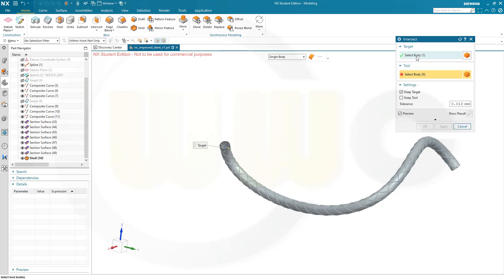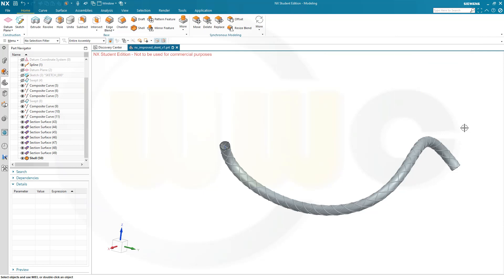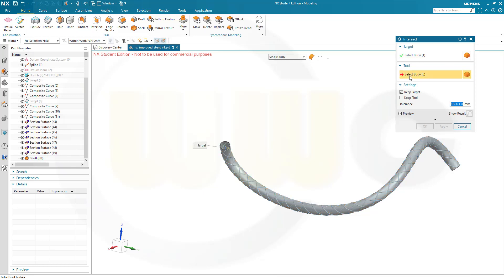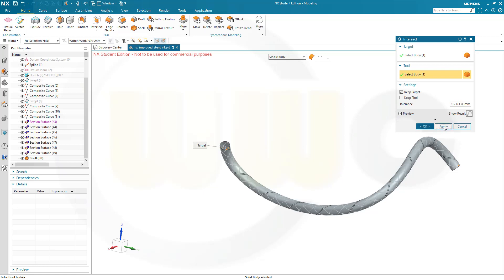The target should be the shell, and the tool should be that section surface. Let's start with this one. And I want to keep the target. Apply.